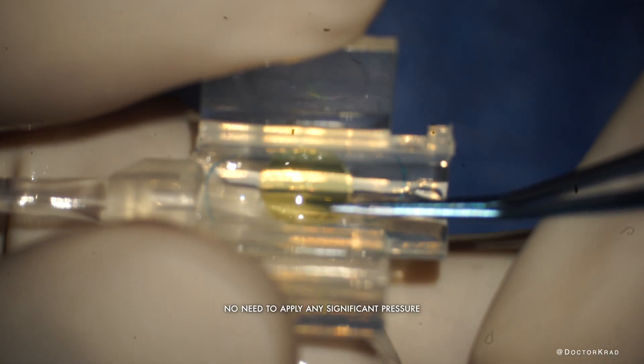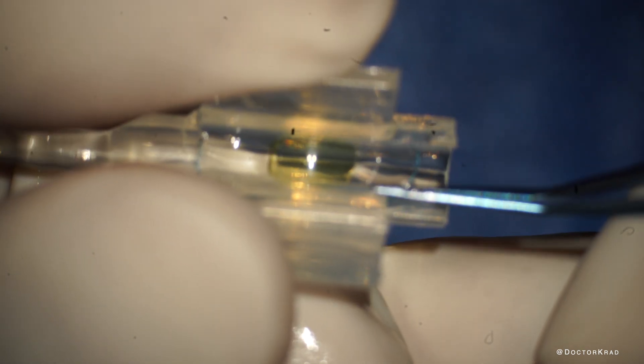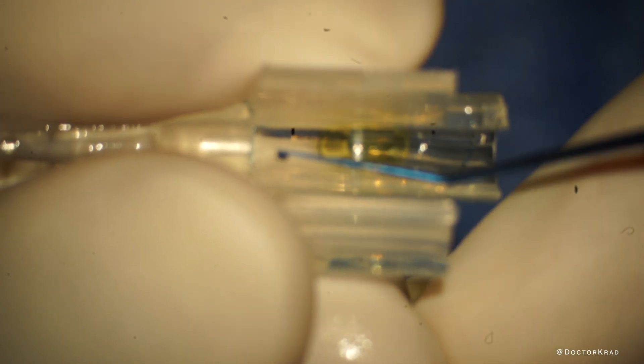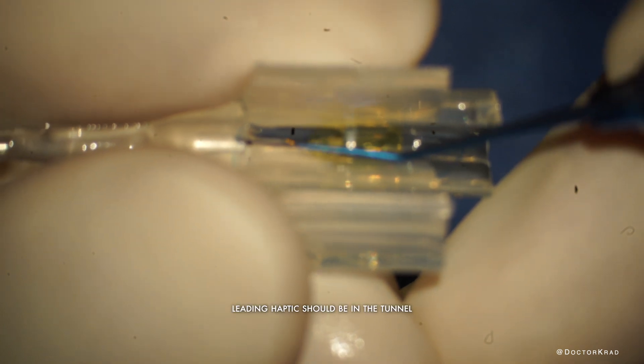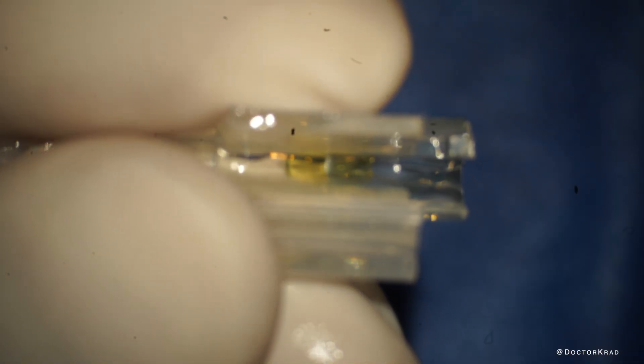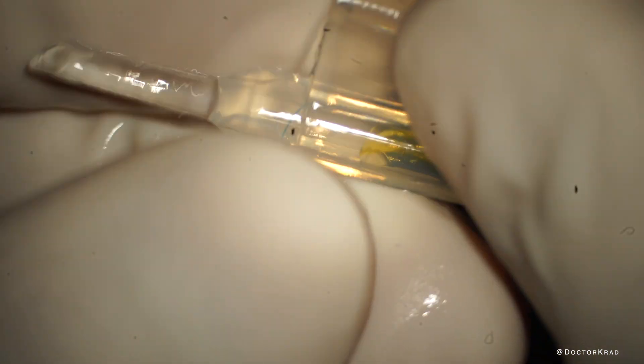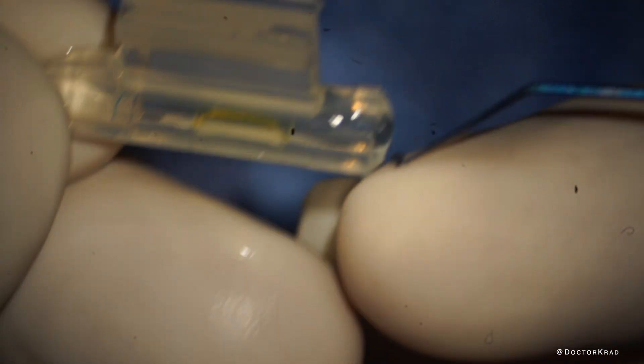You don't have to press down on the lens but you can put an instrument to inhibit it from floating up. As you fold the wings of the cartridge halfway, the lens will be locked in position. And then you want to make sure that the leading haptic goes into the tunnel of the cartridge. So as you snap it closed, make sure that the leading haptic is in the tunnel and it's not trapped or kinked.